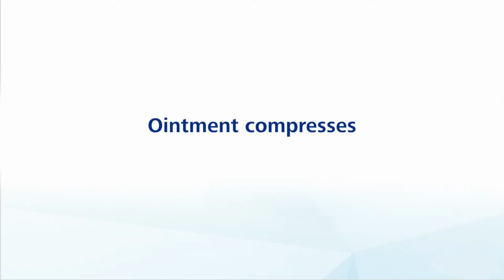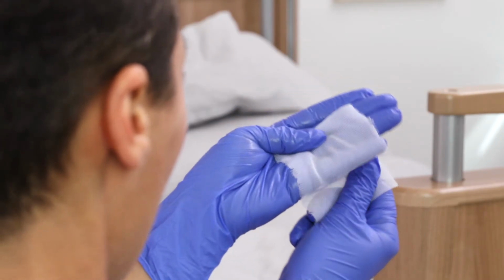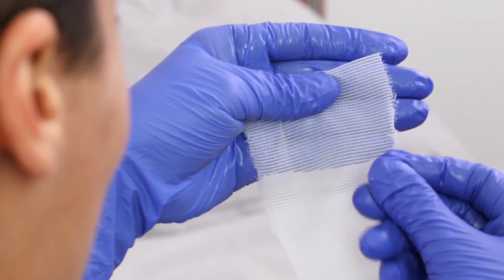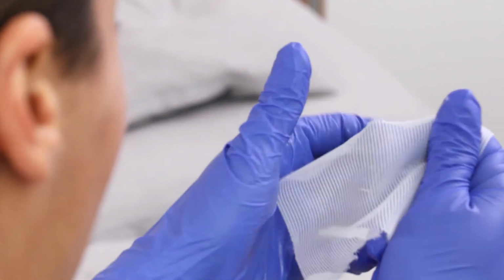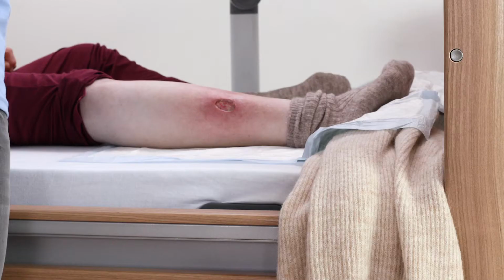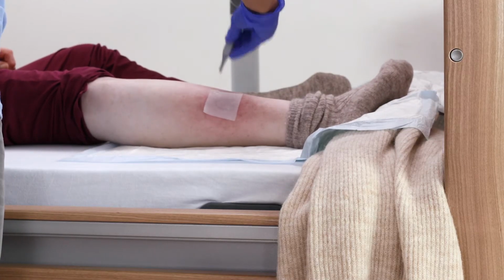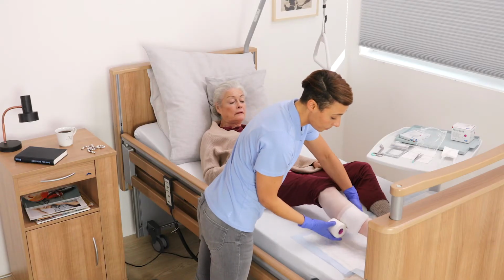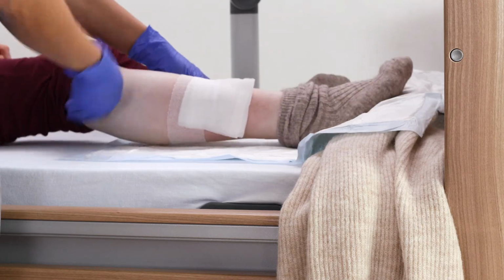These compresses, impregnated with an active-substance-free, neutral ointment compound, do actually belong to dry wound care. They serve as an intermediate layer so that the dressing does not stick to the wound. An overlying compress ensures the absorption of excess exudate. Both pads are fixed together with an elastic bandage.